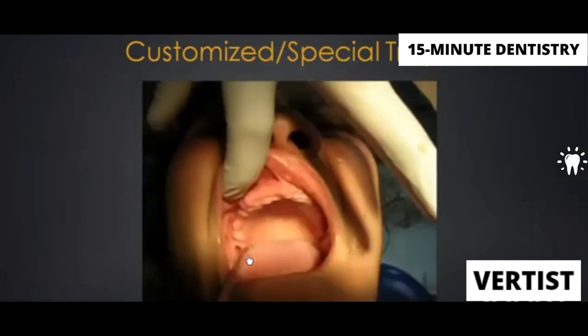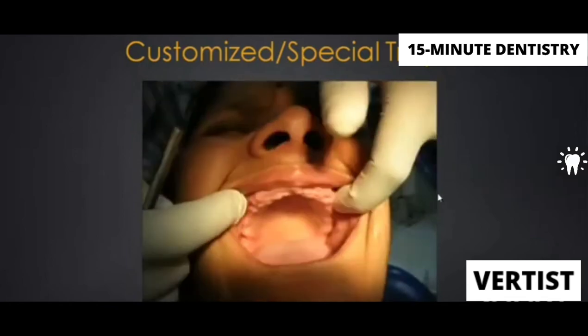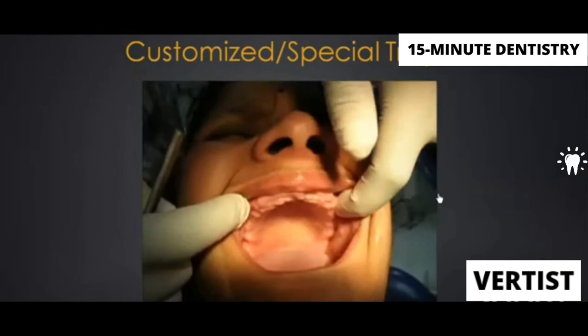I hope all of you know. So it has to fall in the hamular notch. Once you have checked that on both the sides, wait, I am now asking the patient to say ah. When the patient says ah, when I start the video, you will see the palate. This is the soft palate. This part of the palate going up. Okay, and the point from where it starts going up is the point where your posterior vibrating line is.